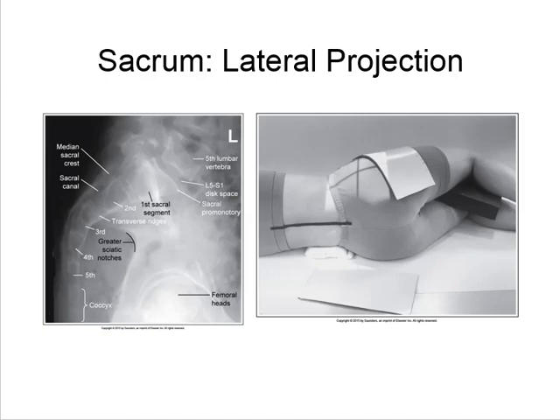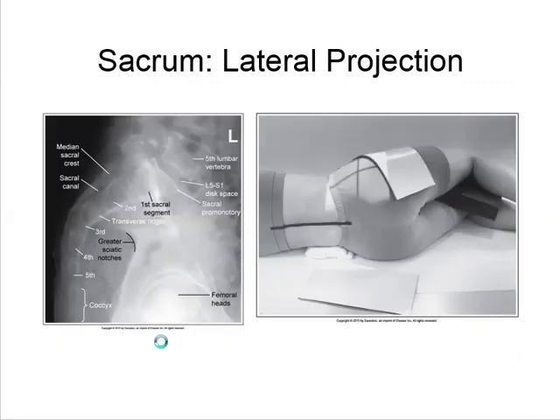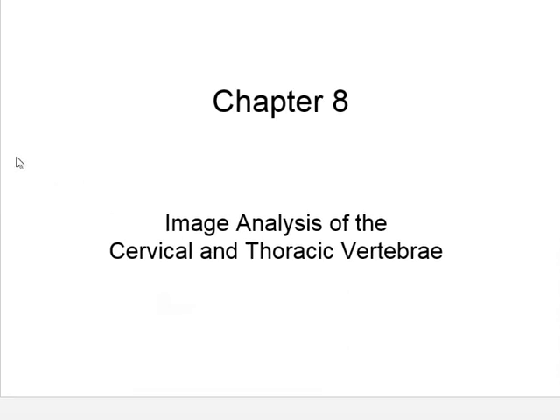So positioning coccyx we just talked about, and that would be it. I'm going to open the PowerPoint for T-spine because we did not finish that, and we'll run through that just real quickly, and then I'll post this and we'll have a test on the 24th.